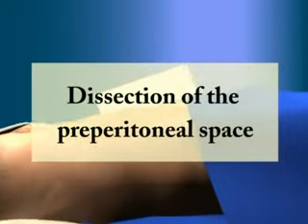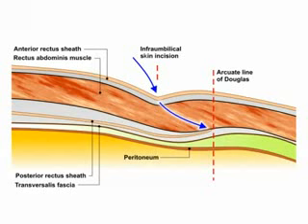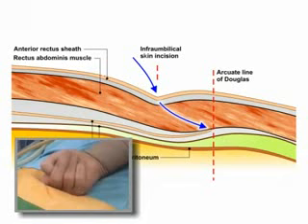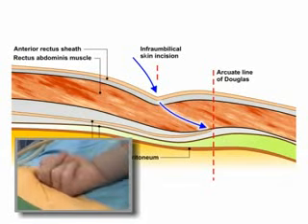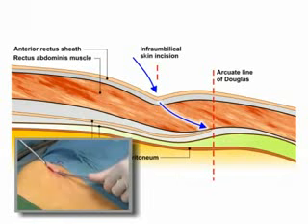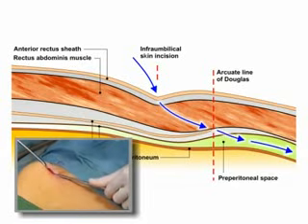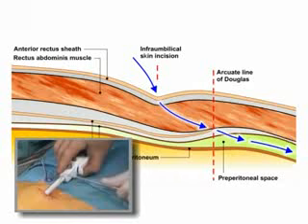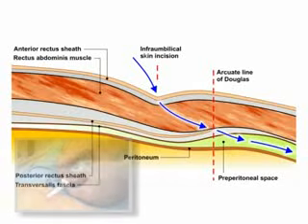The initial step of the procedure is the creation of the extraperitoneal space. A 1.5 cm right infraumbilical skin incision is made, followed by an incision of the anterior rectus fascia. The rectus muscle is separated bluntly down to the posterior rectus fascia. Superficial to this fascia, finger dissection of the extraperitoneal space is performed, allowing placement of the balloon trocar.